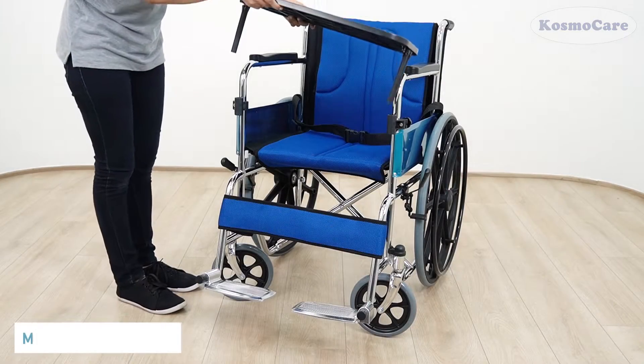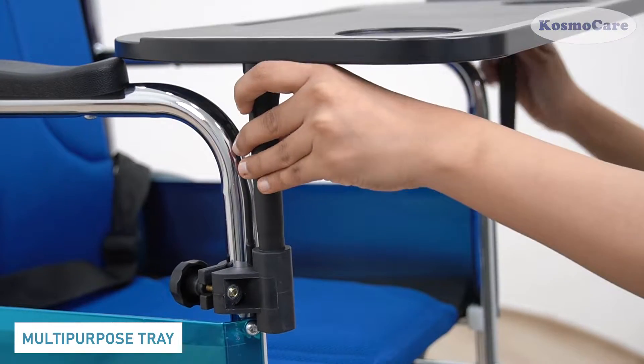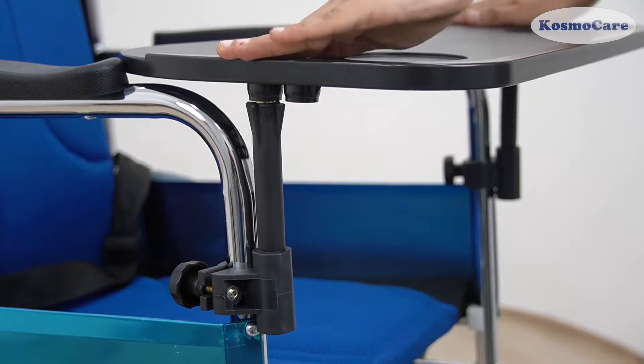The portable and convenient multipurpose tray provided is ideal for users to eat, write, work, and more.